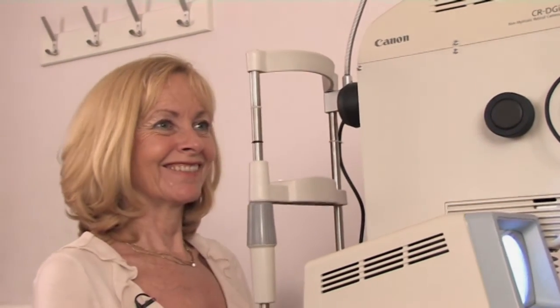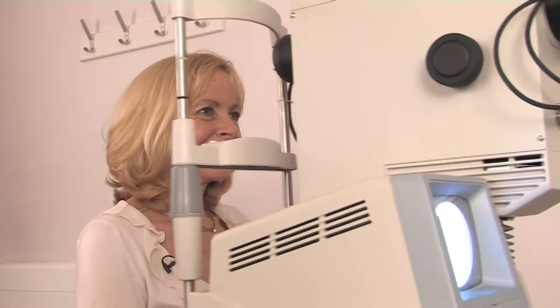And that's all the photographs taken for you. Well done. You can sit back and relax now, and we can have a look at what we've got. That looks interesting. Yes, that's what the back of your eye looks like. We take two views of the back of each eye, which is the requirement of the National Screening Programme — two of your right eye, and then two images of the back of your left eye.